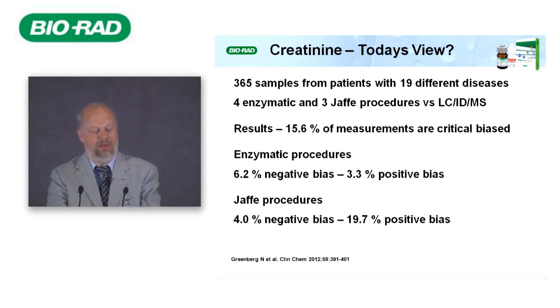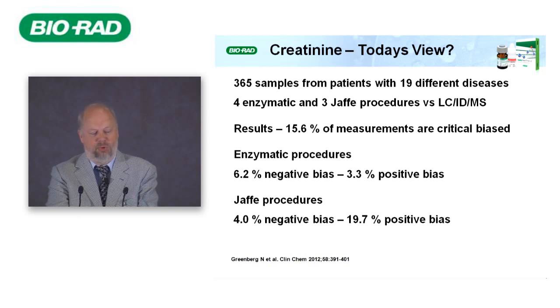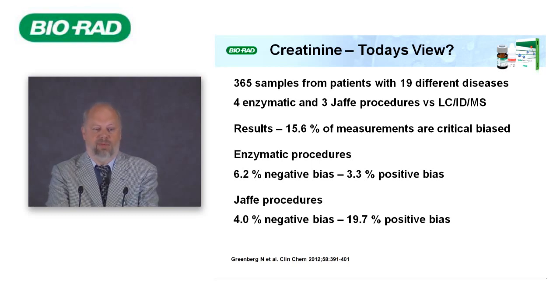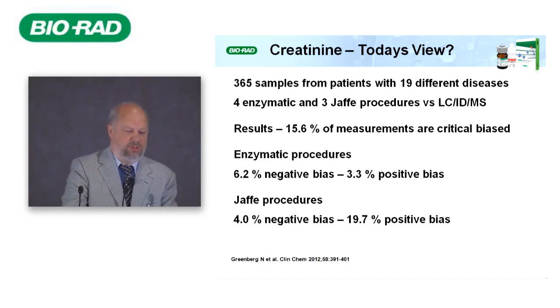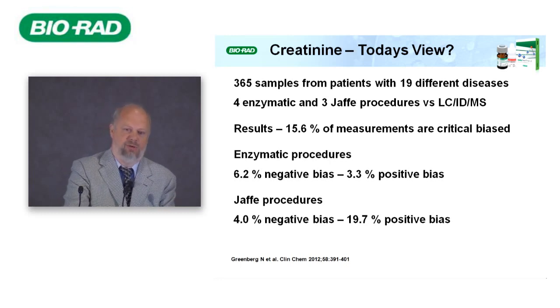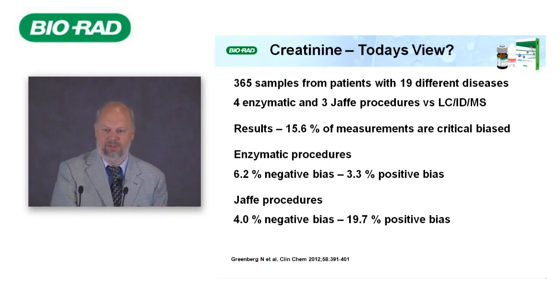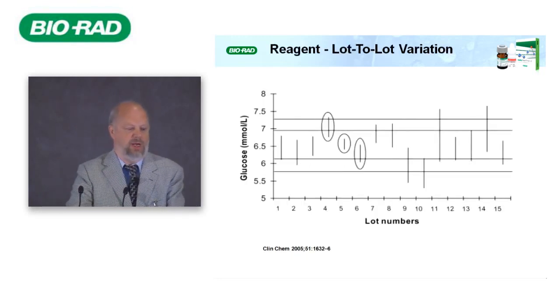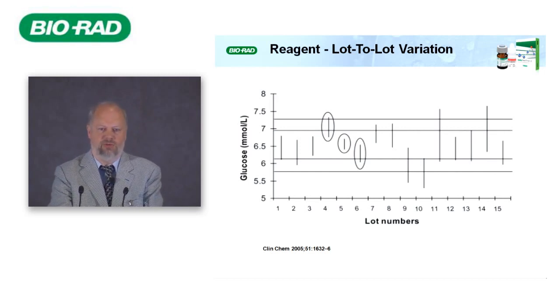The creatinine method we use today: here we have a nice experiment — 365 samples from patients with 90 different diseases were sent out to different procedures to measure creatinine against a reference procedure. We compared four enzymatic and three Jaffe procedures. About 16% of measurements were critically biased. In the enzymatic procedure, 6% had a negative bias and 3% a positive bias. The Jaffe procedure — no one should be using it, it's a 100-year-old method, it's cheap but creates a high number of errors that the healthcare economy ultimately has to pay for.